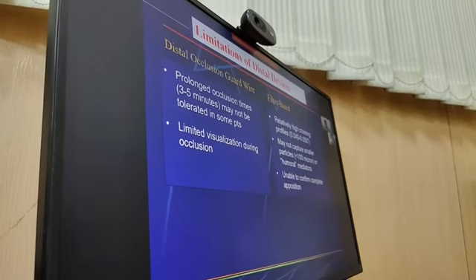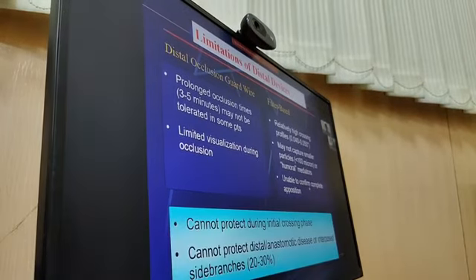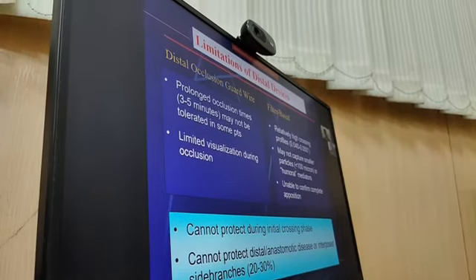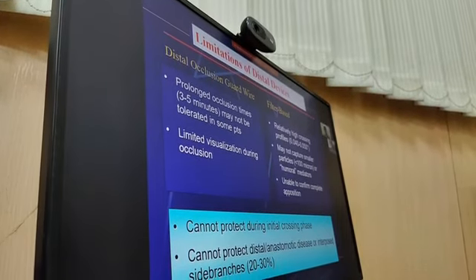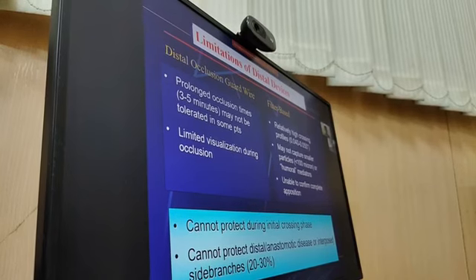While in proximal protection, that is not there. Plus very small particles, less than 100 microns, and something which may go beyond the circumference of the protection device, all those things can occur.